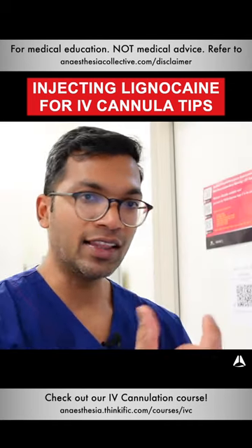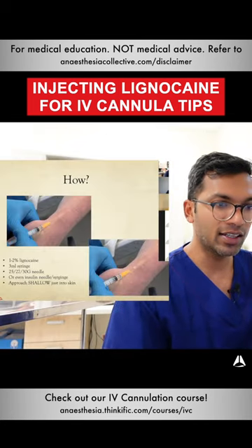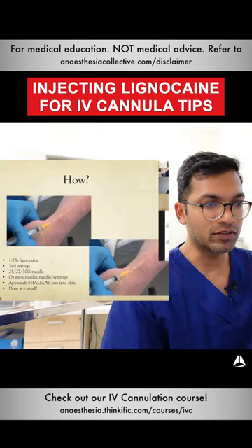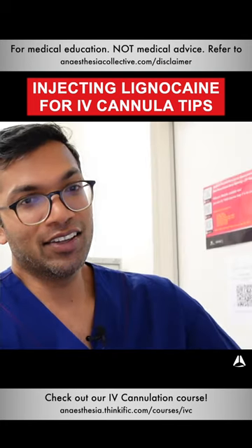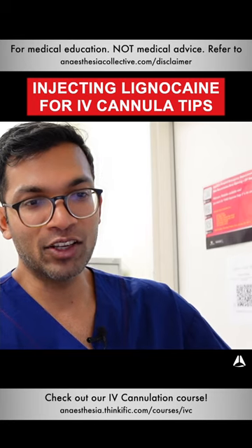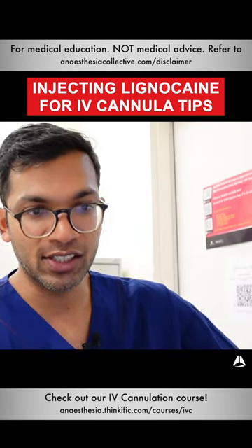I just draw it up in the insulin syringe and inject as needed. Approach shallow, just into the skin — as you can see, that's a really shallow angle. The dose is very small: 0.1 to 0.2 mils, but really I don't think I'm even putting 0.1 mil in. That amount of blanching you can see is less than 0.1 mils, and that's all you need. It's instant analgesia — you don't have to wait.